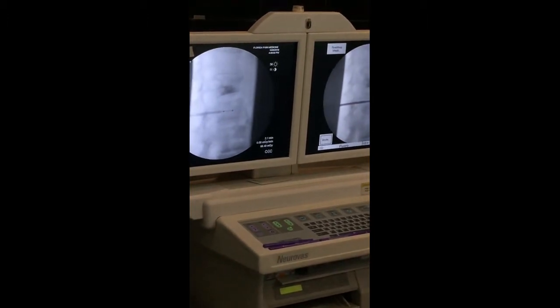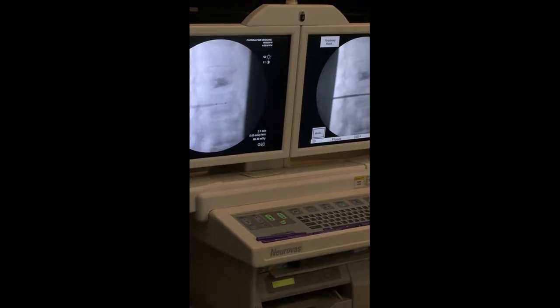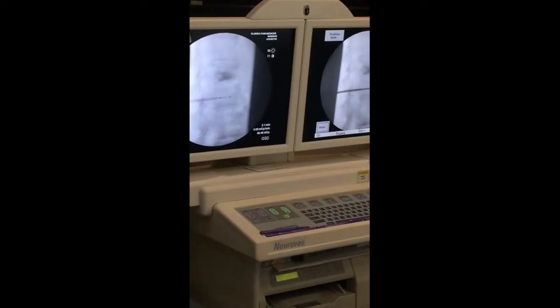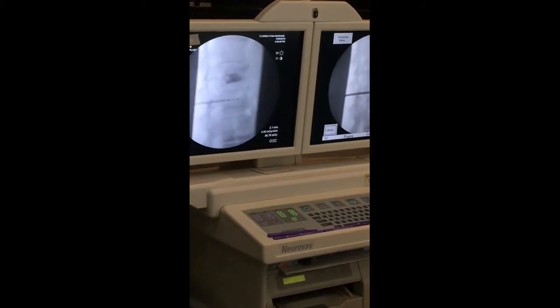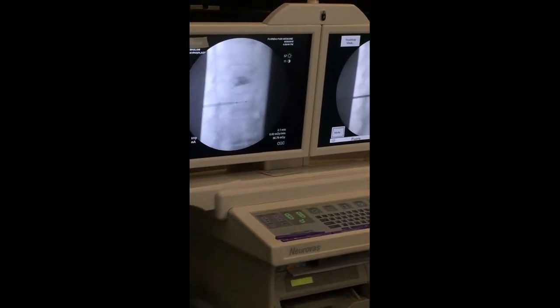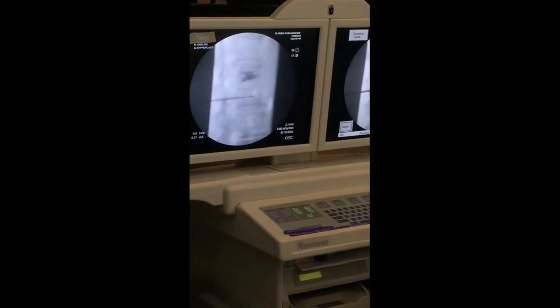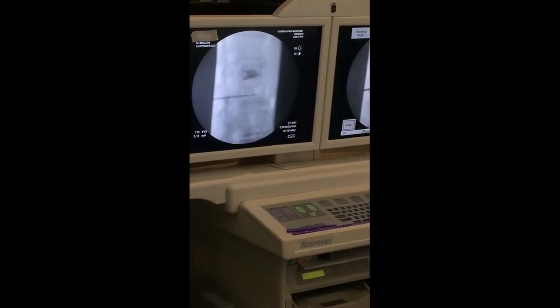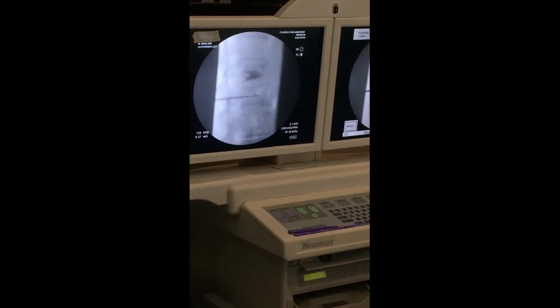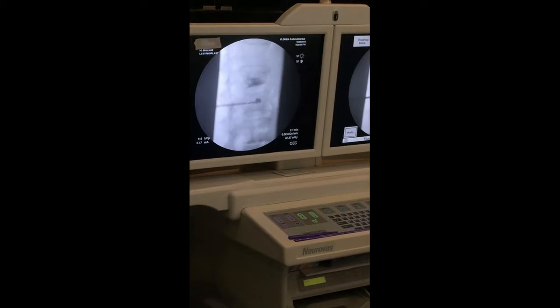Keep going. You may not see that balloon actually. What's that? I was just telling him you can twist it a good amount to get it going. Yep, you got it. Keep going. Now your pressure is going up. Once you see that pressure going up, you're going to start seeing that balloon starting to inflate. Okay? You see that balloon starting to inflate slowly and surely now? Yep. Okay? Go ahead and save that picture, please. There you go. That balloon is inflating.